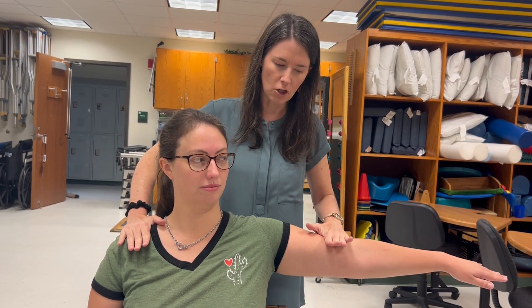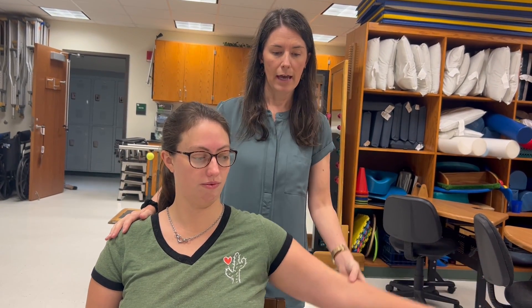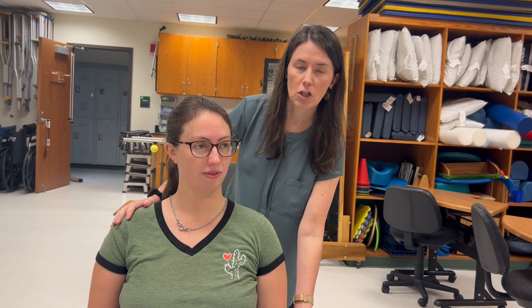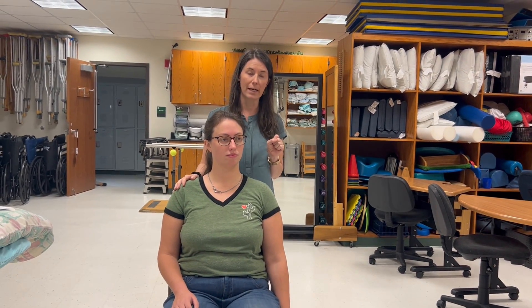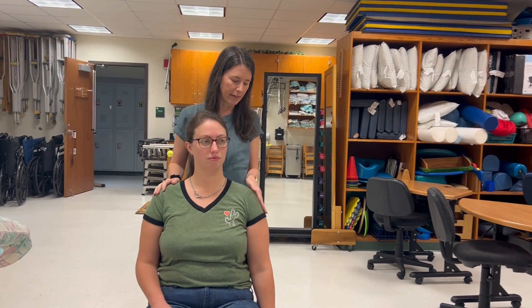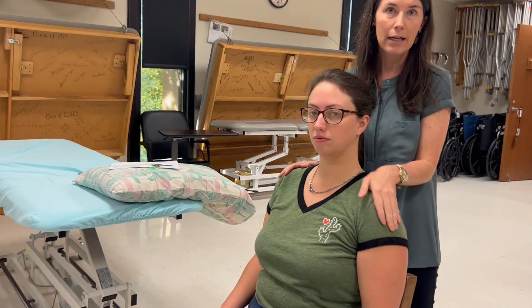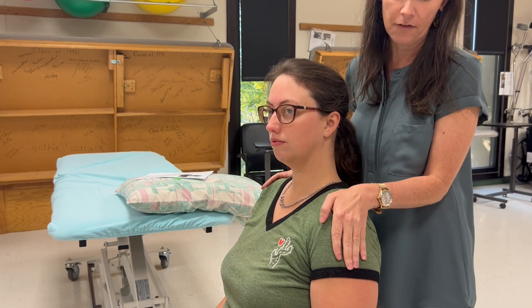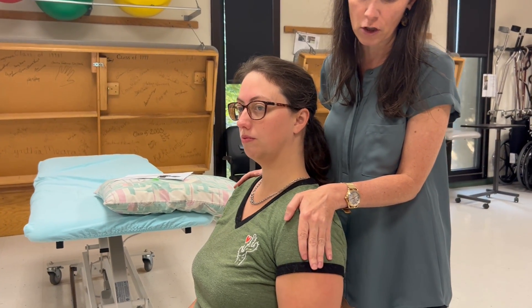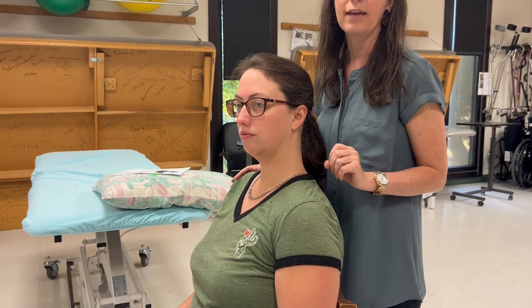Don't let me push you down — stay strong. So that tests grades four and five. And then if she couldn't move through that partial range against gravity — which was our grade two range — and I'm palpating for a one or a zero, instead of being anterior for the shoulder flexors, I move lateral because I'm trying to capture the abductors. If I had her try to bring her arm out to the side but she couldn't do it — if I'm feeling something I give her a one, and if I feel nothing I give her a zero.